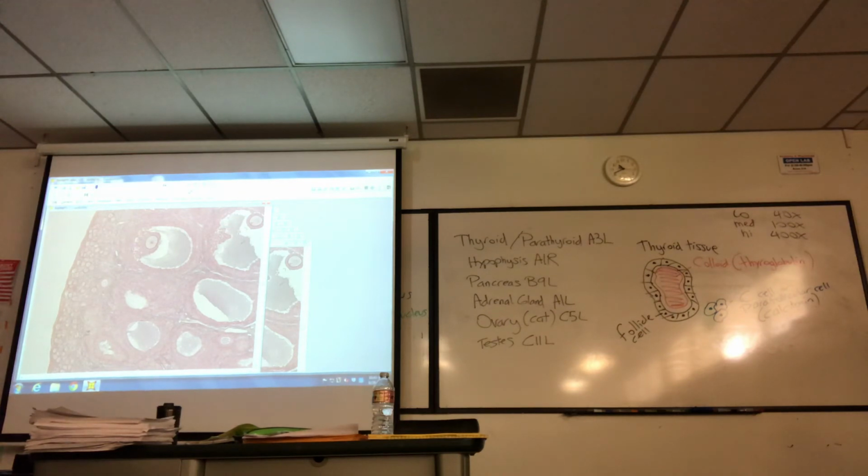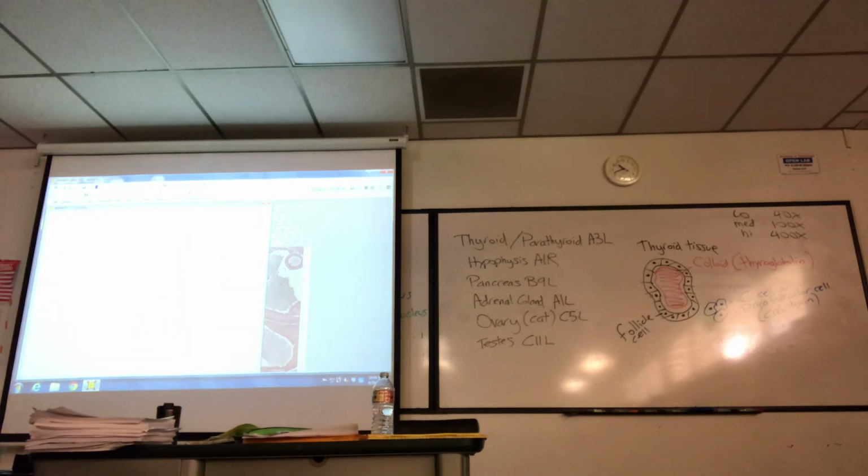We have different follicles. All the ones on the outer edge of the cortex, call them primordial. Primordial follicles in the cortex. That one right there, I classify that as primary. This big one here, I can even see on this low magnification, theca and granulosa cells, and there's a nice oocyte inside. That's graafian. I see no secondary, so let me look around. As you go to a low mag and scan around, you get a wider aspect. Oh, there's some good ones.